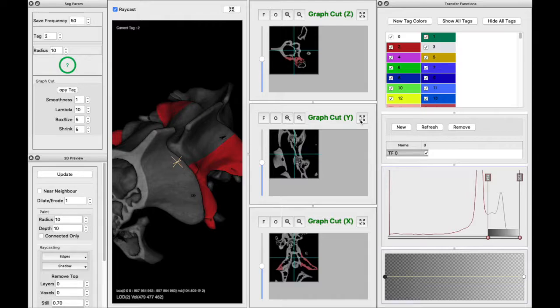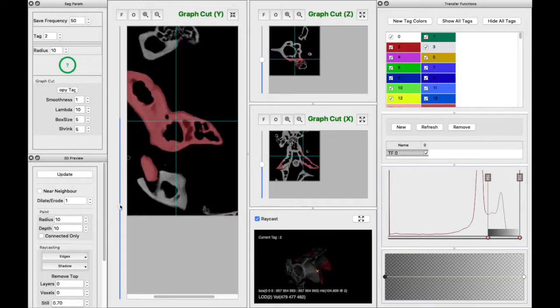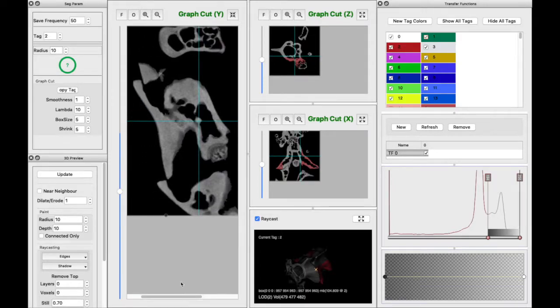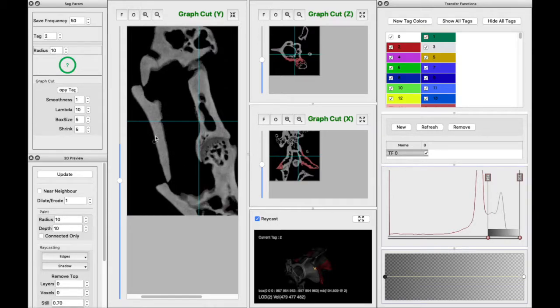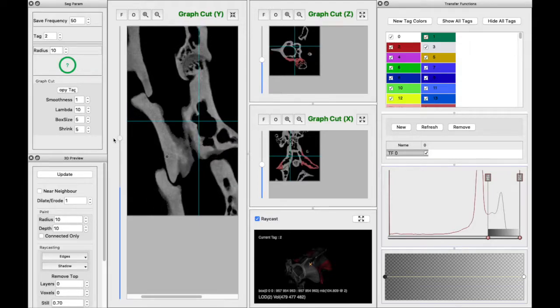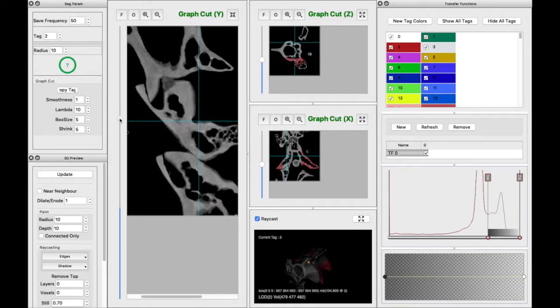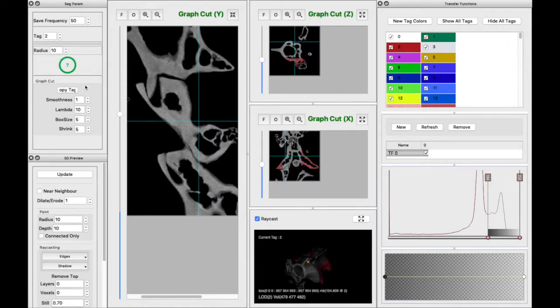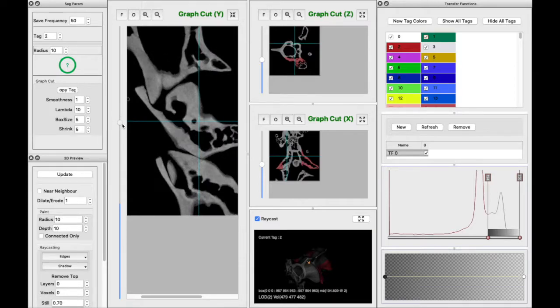So let's go in, which we were in the Y view. That's a pretty quality view. So this is where we're working, and things got more complicated from here. Okay, yeah, see, the condyle is definitely a region where these connect, where you'll go in and just do that region. But up here, it looks like things stay pretty beautifully isolated. So, and then we can do basically the reverse of what we did on the other side. As in, now it's just like the opposite view. We can do that.